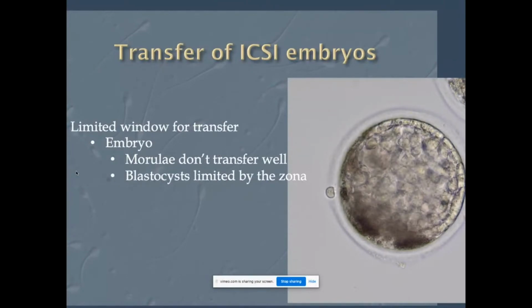So what happens is these blastocysts will not try to hatch, or basically they'll try to enlarge and stretch the zona, but they'll start oozing out through the ICSI hole. They'll basically herniate. Enough herniation can potentially lead to an identical twin, another blastocyst, although that's probably not the way these occur, but it's a concern.